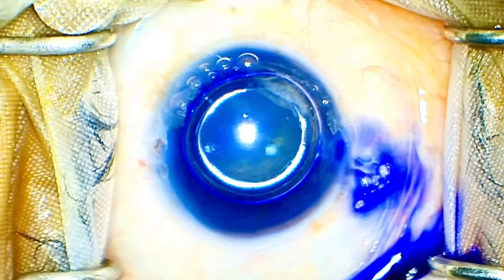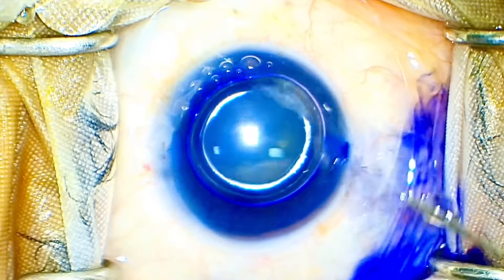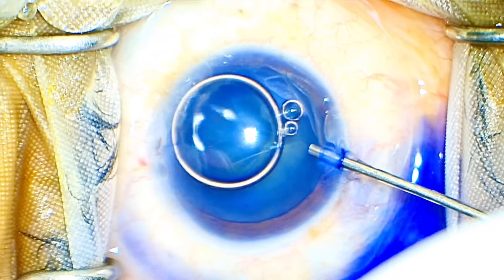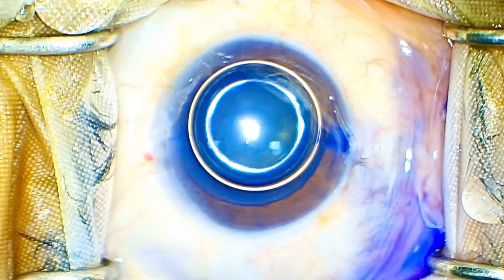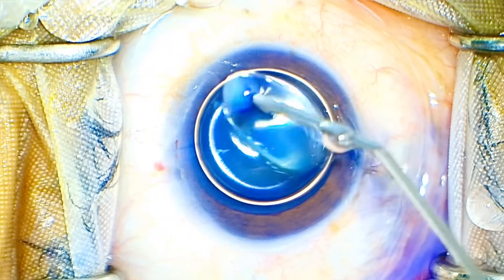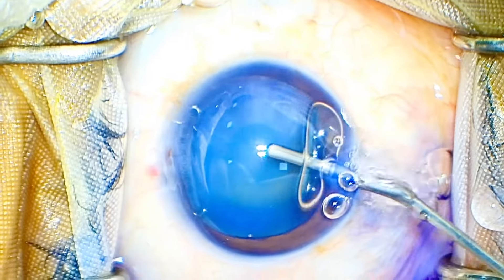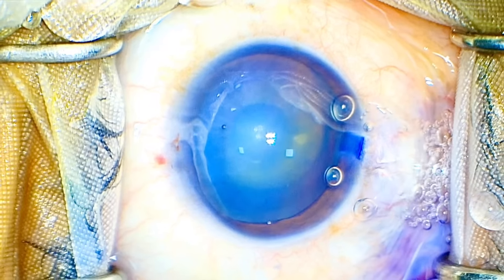Right off the bat I have made two really nice side ports. I have stained the capsule and told my OT assistant to assist me — what seemed like another normal routine case. Had I known what I was going to face, I would have kept a lot of my courage ready. But yes, things can catch you off guard sometimes, and you should be ready for any consequence you are going to face because you are a surgeon.